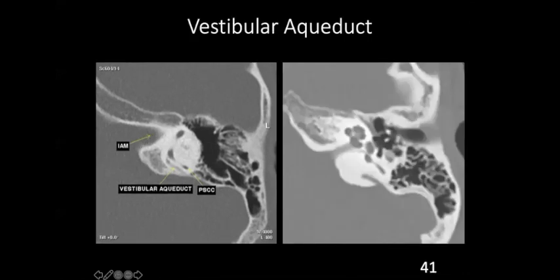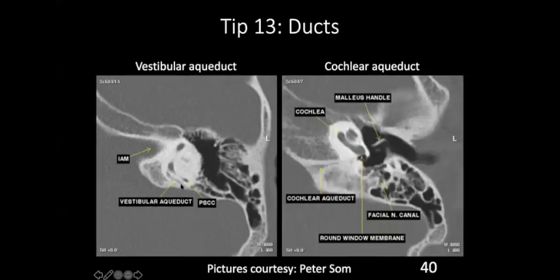The vestibular aqueduct is perpendicular to the internal auditory meatus. Remember: vestibular aqueduct is parallel to the posterior semicircular canal and posterior surface of the temporal bone, but perpendicular to the internal auditory meatus. For the cochlear aqueduct, always look at the basal turn of the cochlea and look for the air bubble at the lateral end of the basal turn — this is the round window niche area. The cochlear aqueduct connects the basal turn of the cochlea to the posterior fossa, immediately medial to the round window membrane.